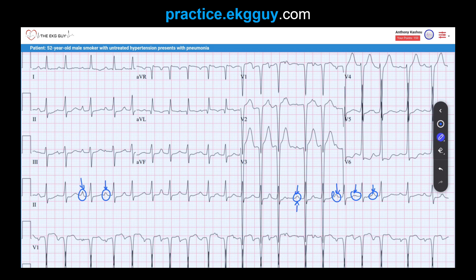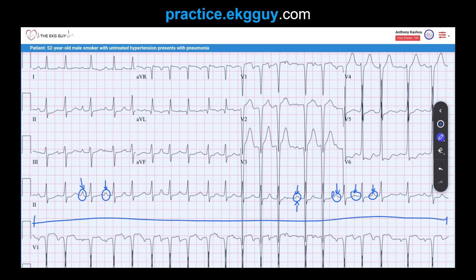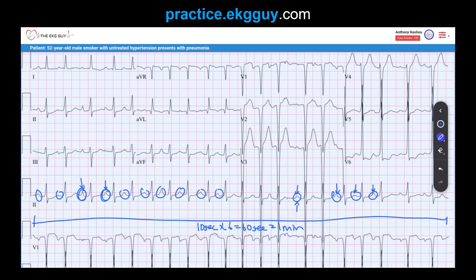The atrial rate was fast. A standard 12-lead ECG is 10 seconds; 10 seconds times 6 equals one minute. If we count the P-waves across the strip and multiply by 6, we get the atrial rate. Counting: one, two, three, four, five, six, seven, eight, nine, ten, eleven, twelve, thirteen, fourteen, fifteen, sixteen, seventeen, eighteen, nineteen, twenty P-waves.